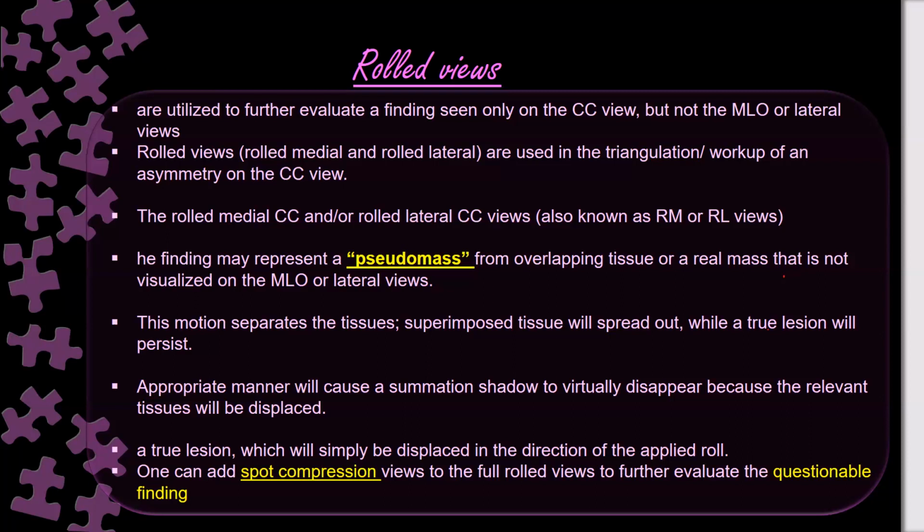You will do the roll view. You will move the superior portion of the breast, okay? If it disappears, then it can be a pseudo lesion. If it persists, that means it is a real lesion. Then if it is a real lesion, I will try to move it as much as I can toward an area of fatty breast, so the visualization of the lesion will be easier.